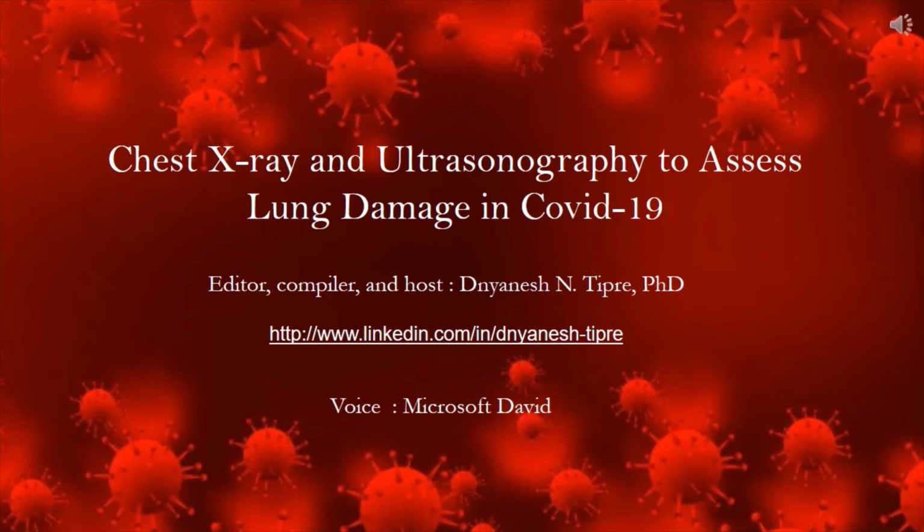This presentation would show 16 slides. It describes applications of portable chest X-ray and ultrasound to assess lung damage in COVID-19. It would describe basics of X-ray and ultrasound along with imaging procedures.